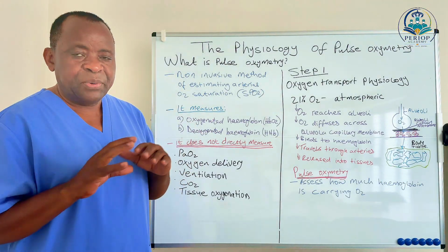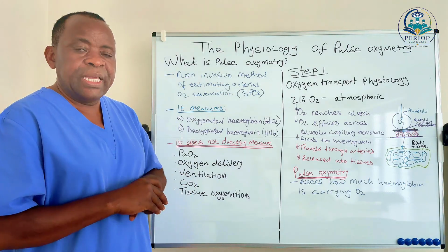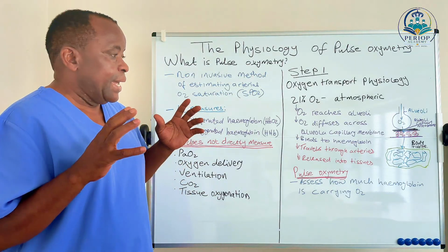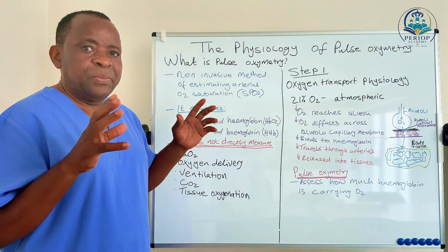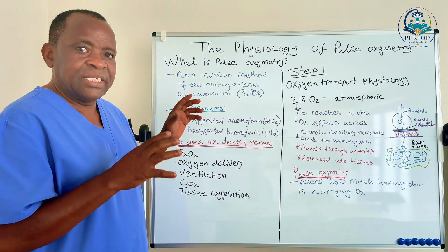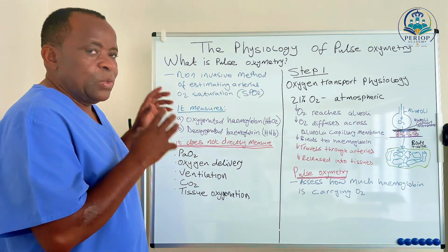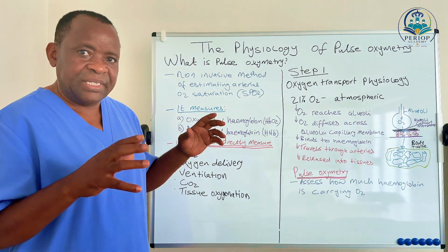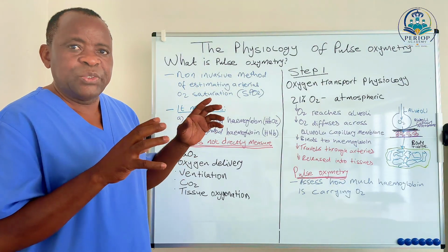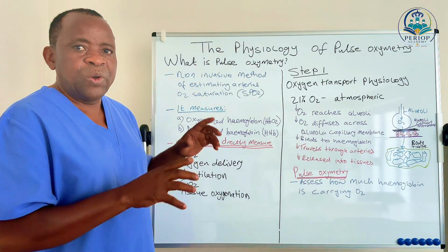As I promised in my previous video, we're going to look at pulse oximetry and how it works. However, this discussion is very brief and directed to the points I want to share with you, looking at a patient as they are taken care of in the anesthetic room, in recovery, and back to the ward.